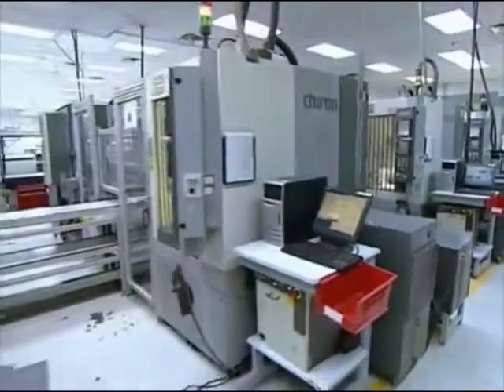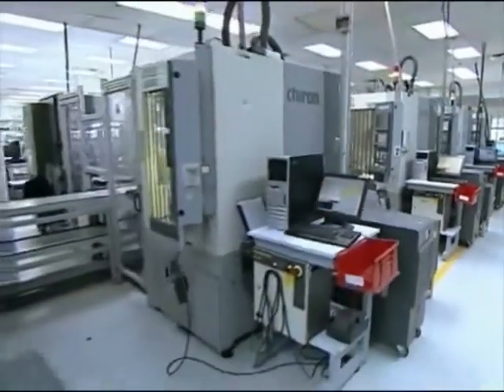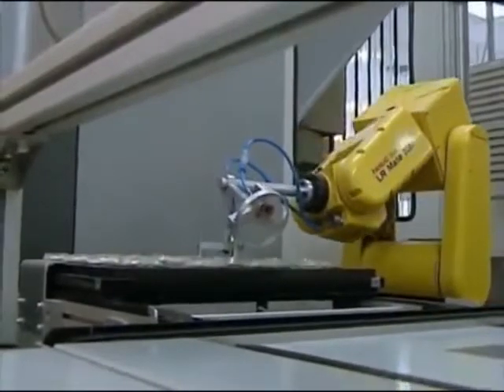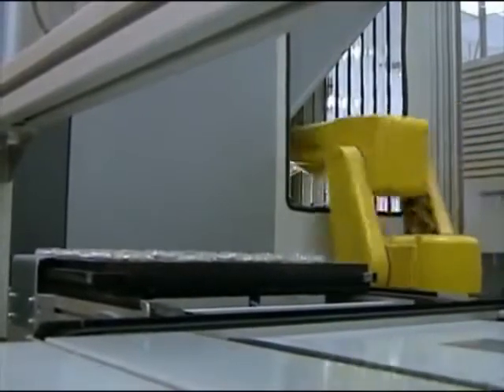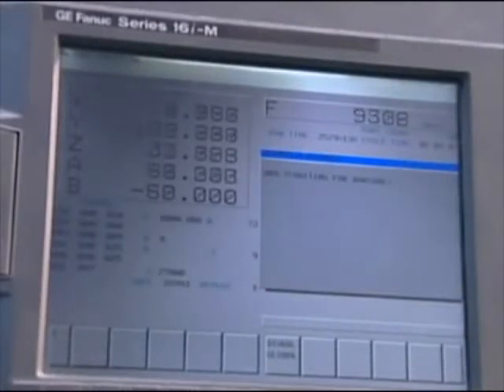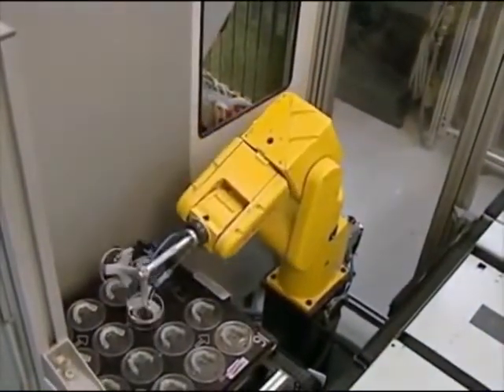Aligner trim is another operation which uses industrial milling machines, but these milling machines have been souped up so that we can run them 24 hours a day, 7 days a week, and always have them available. What happens in the aligner trim stage is truly unique. In real time, we use the data label on each aligner to access the virtual data provided by the doctor's approved ClinCheck. That data is then digitized into a computer numerical controlled path, or CNC, and is used to make the gingival cut based upon the ClinCheck data. As you see, all of these pieces of treatment data have been linked together. It takes a tremendous level of complexity and data control to execute this successfully every time.